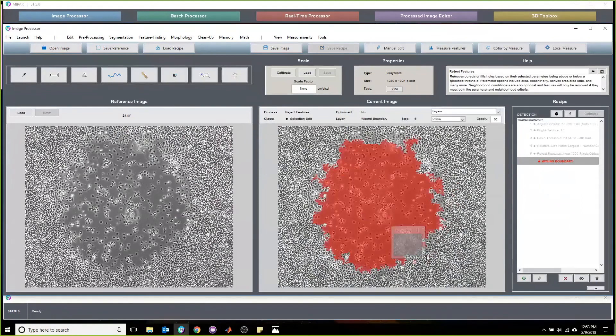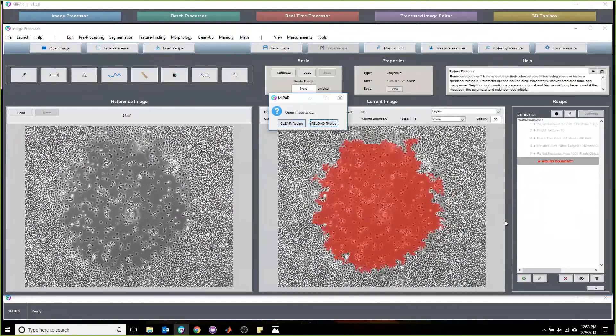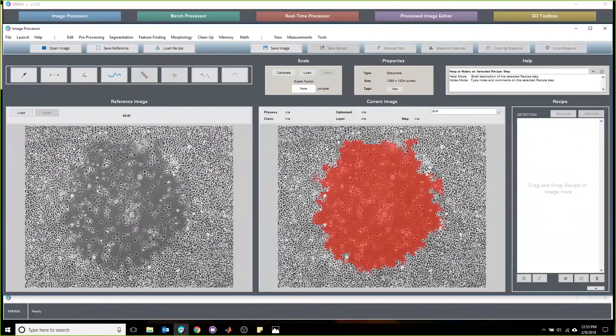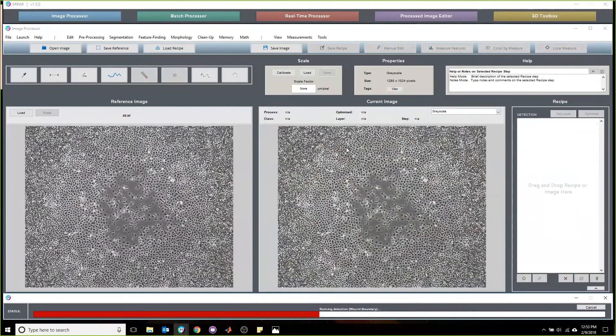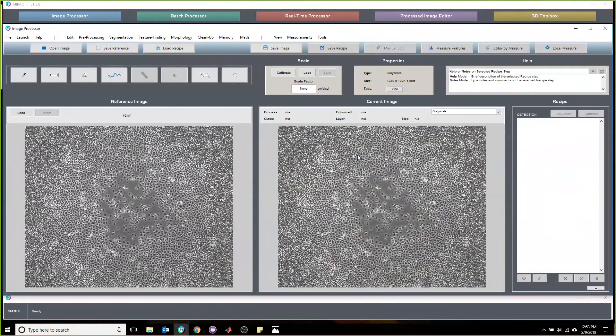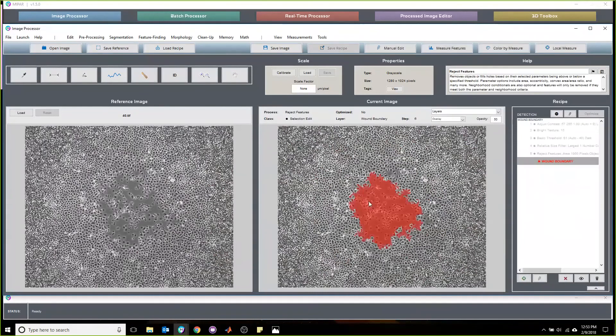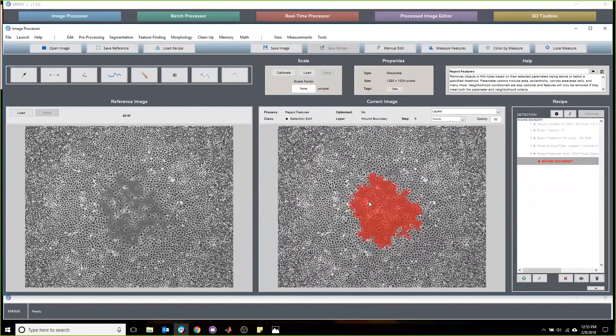A recipe that is this robust is very helpful in a high throughput laboratory where you know that as long as you capture your images consistently, you can apply the same recipe to hundreds, if not thousands, of these and get data that you can rely on.